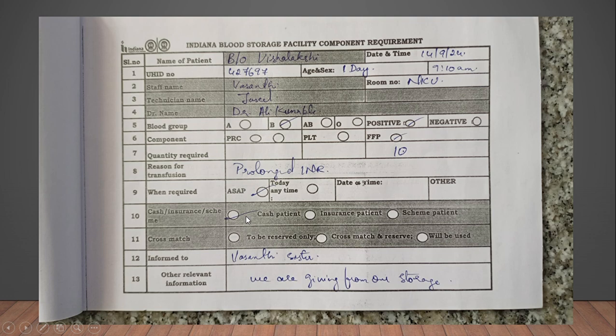Okay, then you have to check what type of patient it is, whether it's an insurance patient or any scheme patient. The reason is that some schemes don't allow blood components as a part of the revenue transactions. For that reason, we need to check what type of patient it is.